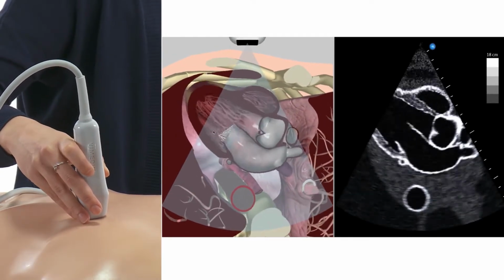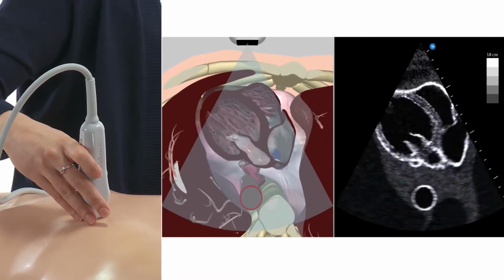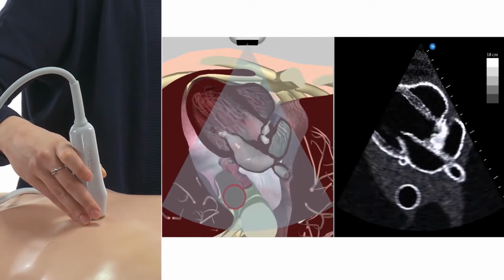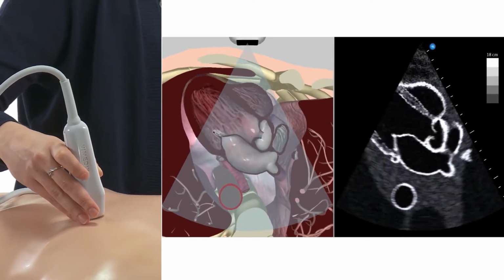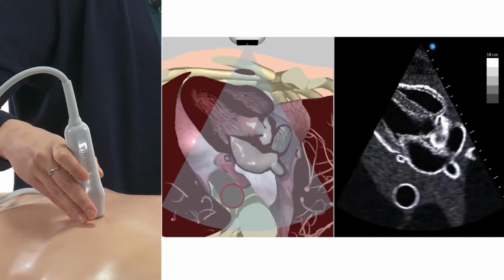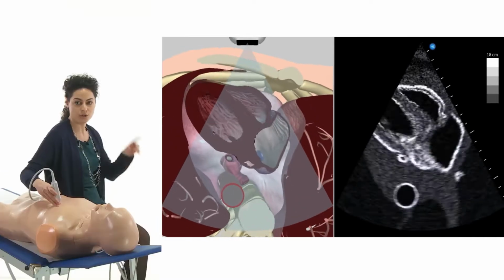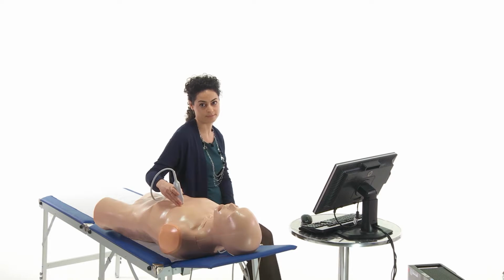And this is also for the aortic valve. So actually, with really small rotations, you see, and maybe now you understand why we don't have the aortic valve in the view, simply because we are losing it with these small movements. Use small movements to get the aortic valve again.